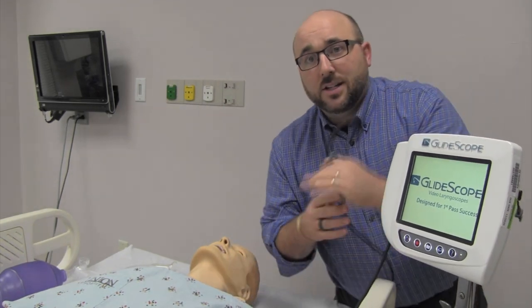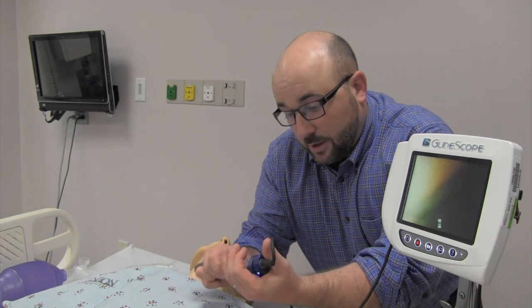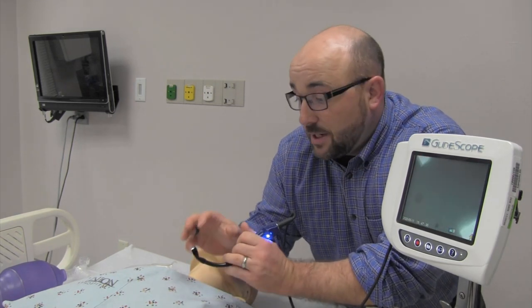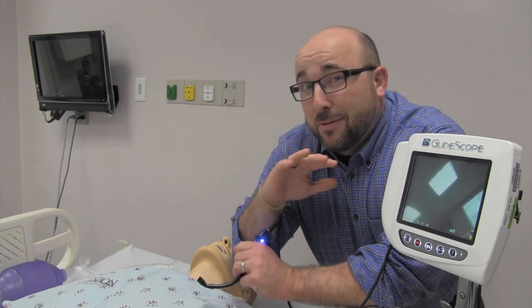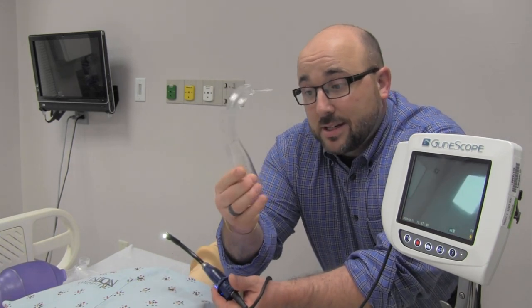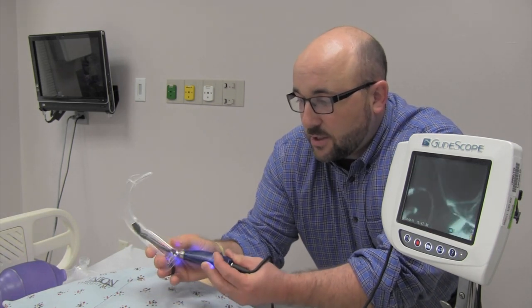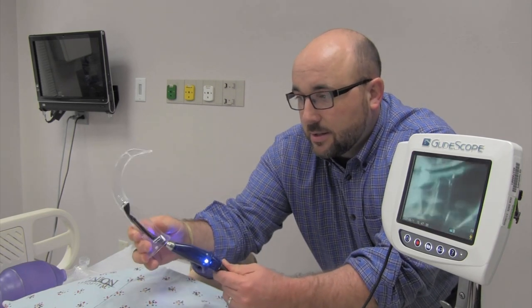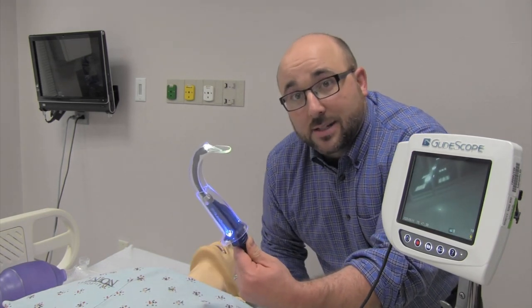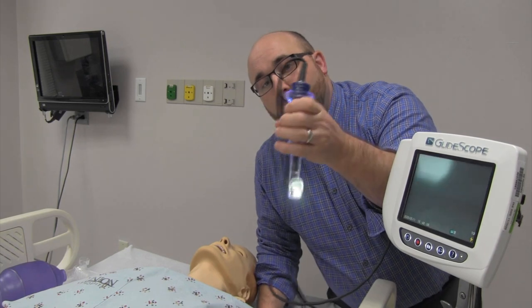The GlideScope monitor — to turn it on, of course, is the on/off button here. Once it comes on you'll see the light come on on your camera. The camera is also a light and it heats up; the heat keeps it from fogging when you go down into that highly humidified area in the oropharynx. The second piece is this plastic cover — these are disposable, this is a size 3, they also make a size 4. It goes on just like this and locks into place, so now it's ready to use.